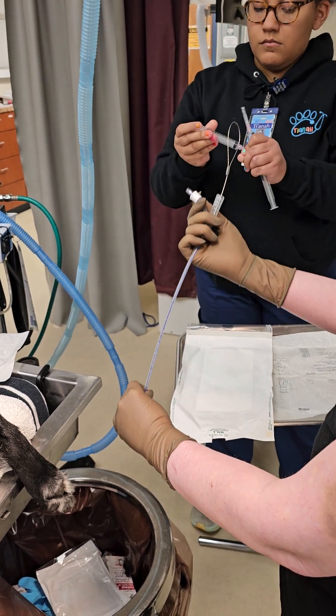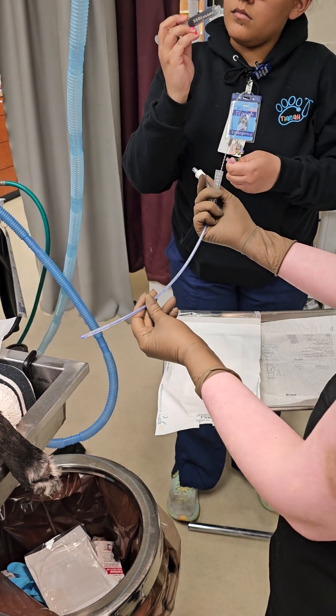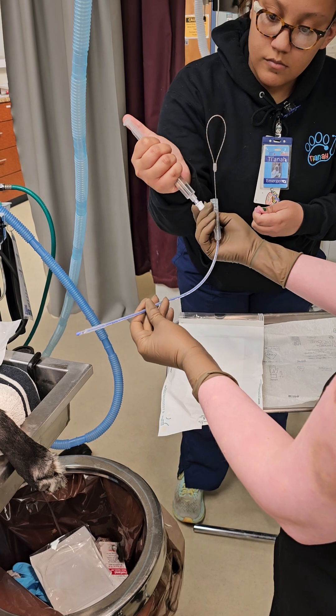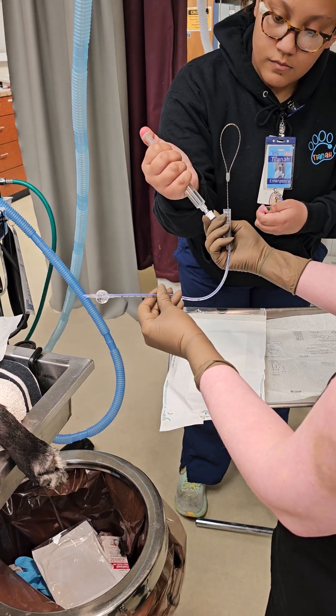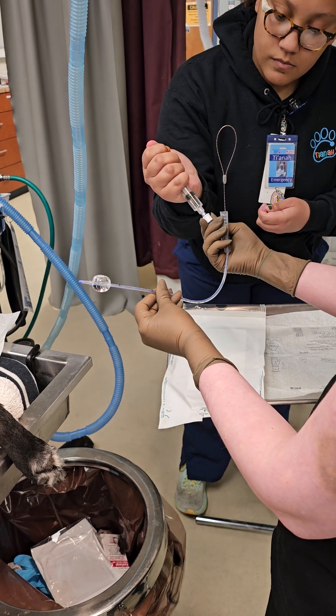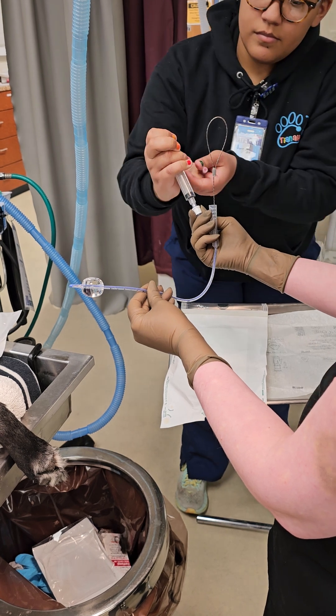Now I'm going to test our balloon. 10cc is the maximum on this particular urinary catheter. Now pull it back out.